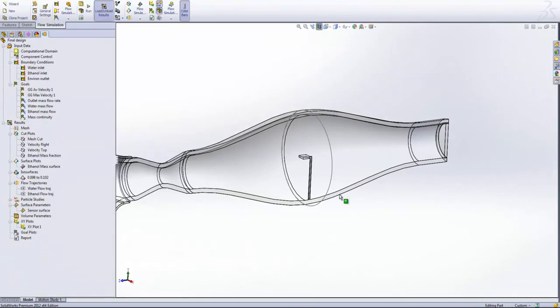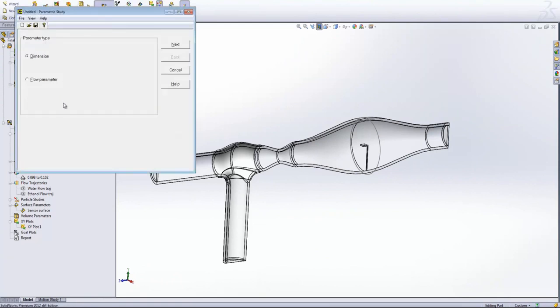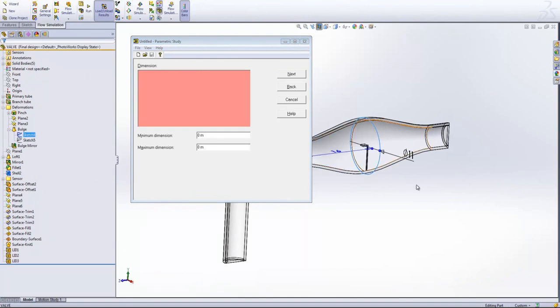So we might want to refine this further, and one way we could do that is simply by varying one of the dimensions, for example the outer diameter of this bulge. And that's very, very easy to do with the flow simulation tool, because we've got this parametric study available to us. So I'm going to select dimension as my parameter type, and highlight the sketch for that bulge. I'm going to use that dimension there. So that pulls that dimension in as a variable. I'm going to say that the minimum value is going to be 5 millimeters, and the maximum value is going to be, say, 15 millimeters.